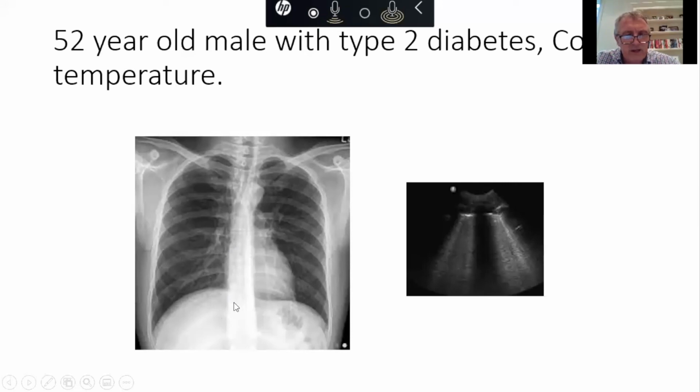If you're in A&E with ultrasound, you can examine the common femoral veins bilaterally and pick up deep vein thromboses. 70% of pulmonary emboli will have demonstrable deep vein thrombosis on ultrasound. So ultrasound is an extremely helpful tool. It doesn't replace clinical, it doesn't replace a chest X-ray. It just adds to the whole picture and actually can help with diagnosis. It's an extremely versatile tool.